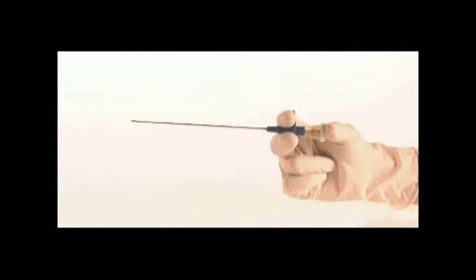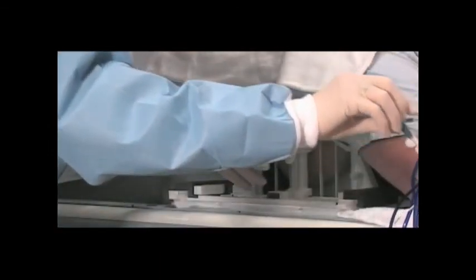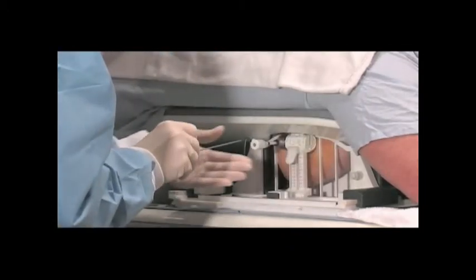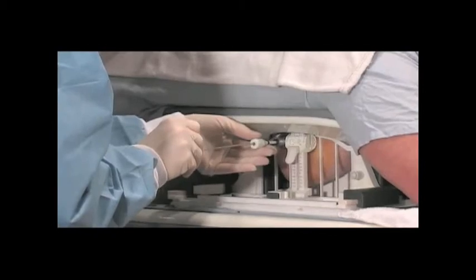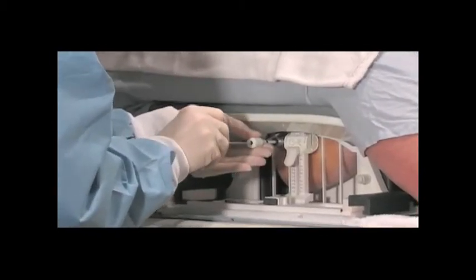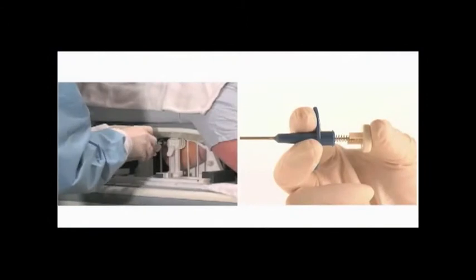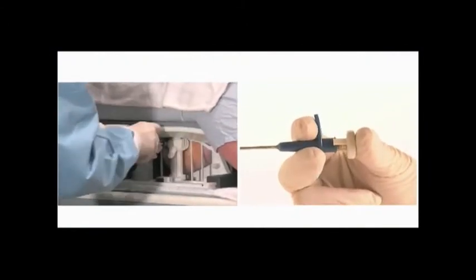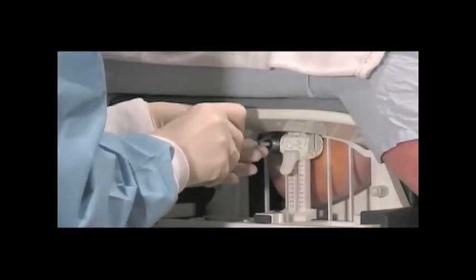You are now ready to place a biopsy site marker. For this video demonstration, we will use the ATEC Trimark. Remove the localizing obturator and place the marker deployment device into the introducer sheath until the aperture indicator contacts the introducer sheath hub. To make sure this position is maintained throughout the deployment of the marker, hold the device in place with your free hand. Deploy the marker by pressing the plunger with your thumb. An audible and tactile click will confirm deployment. Slowly remove the deployment device from the introducer sheath.